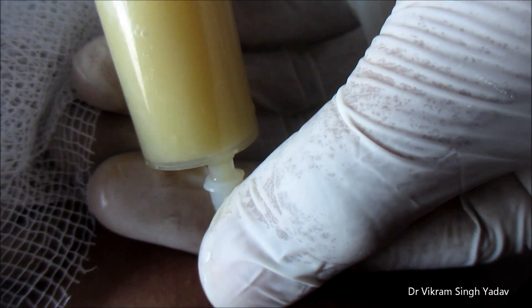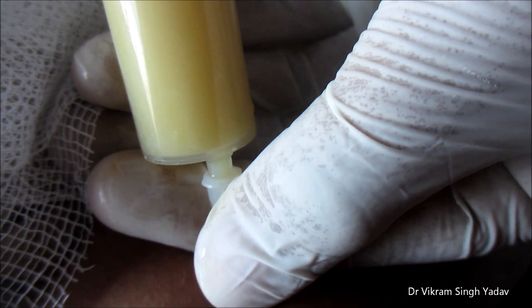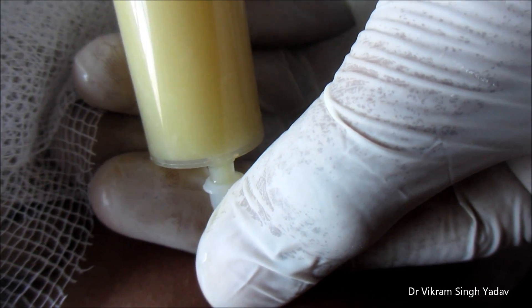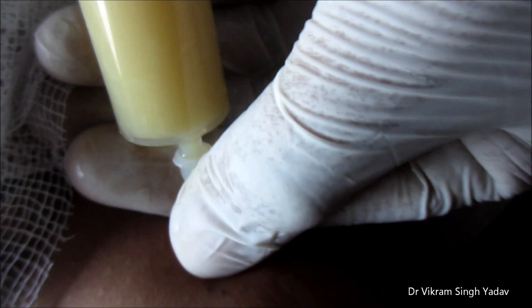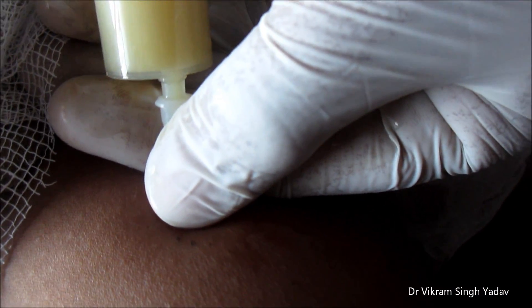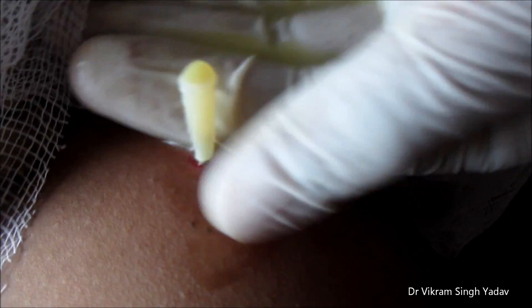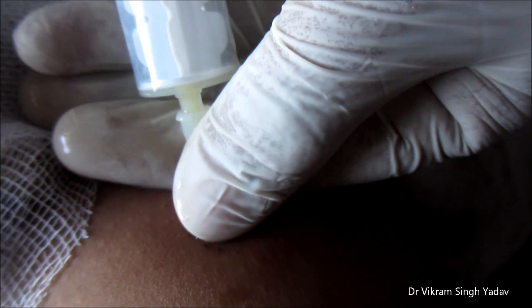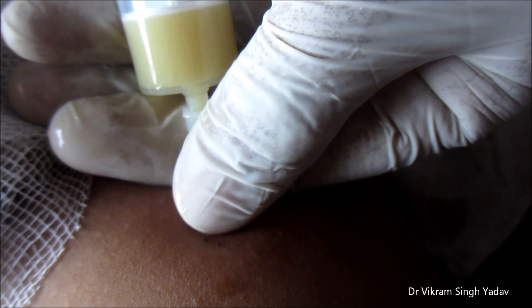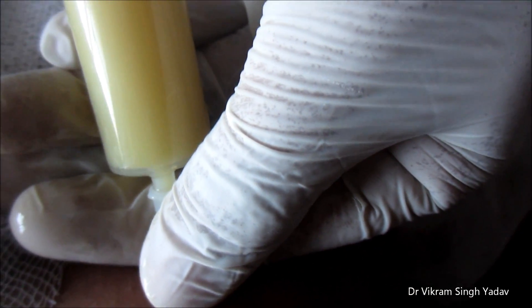Sometimes they are associated with psoas abscess. They should be aspirated with the anti-gravity technique so that a sinus may not be formed. In the case of psoas abscess, CT-guided aspiration should be done. If it is forming again and again despite many aspirations, you need to give incision and drainage.